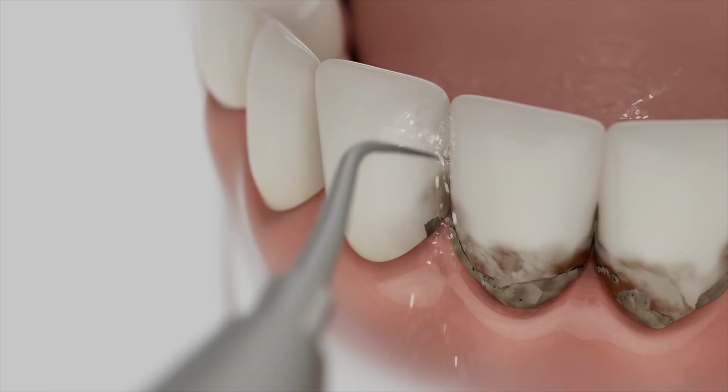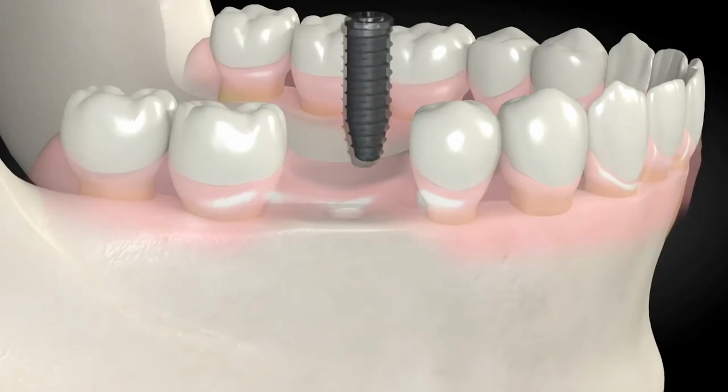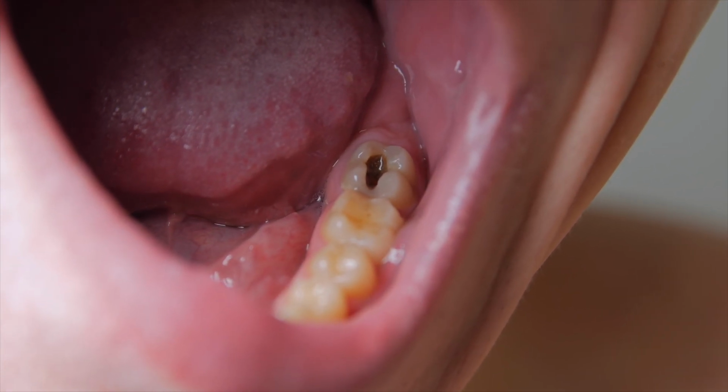The intervention, removing the decay. When you're in the dentist chair, the first order of business is making sure you're comfortable. Local anesthesia numbs the tooth and everything around it, so the procedure is completely pain-free. With the area numb, the fight begins.